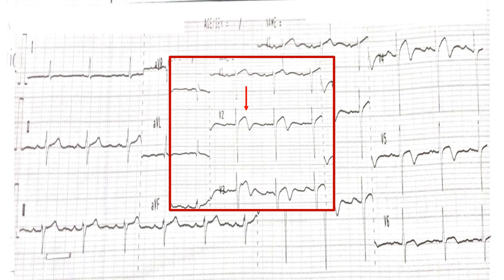I have zoomed in the T waves for you — these are leads V2 and V3. I have marked the findings with arrows. Do you think these are normal, healthy T waves? No. Look at the T waves: there is a positive terminal followed by a negative, then returning to baseline — a positive-and-negative biphasic T wave pattern. Similar biphasic T waves are found in lead V3 as well.